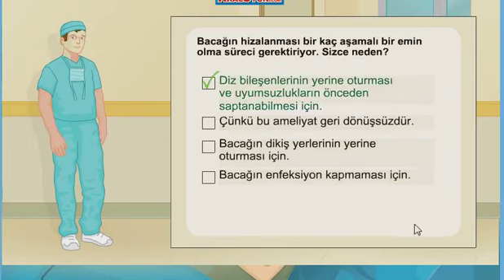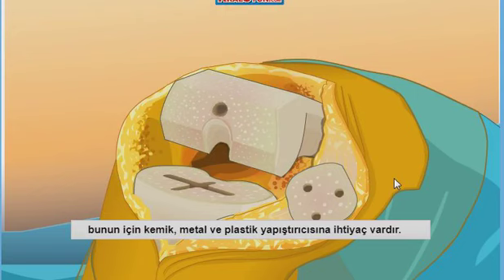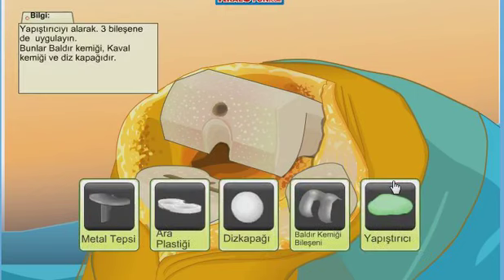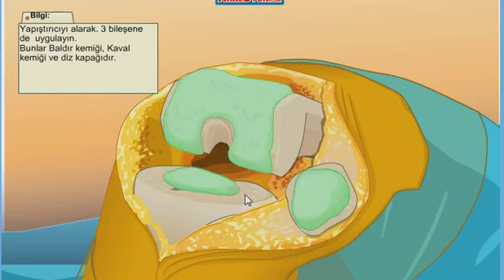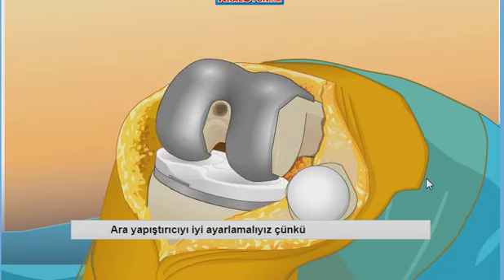Great! We've tested the trial components. Now let's remove them and prepare for the permanent components by applying a special cement compound that binds metal and plastic to bone. A scrub technician has mixed up a batch of cement for you to use. With cement in place, the final components are permanently attached to the knee. Any excess cement will be scraped off and thrown away.